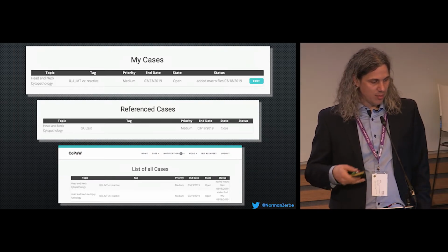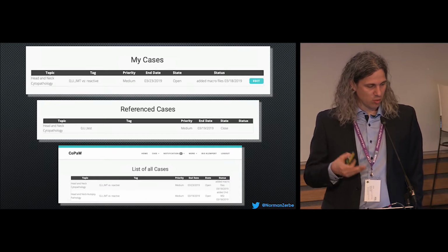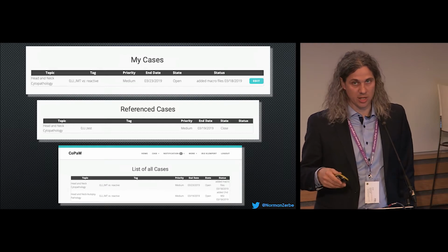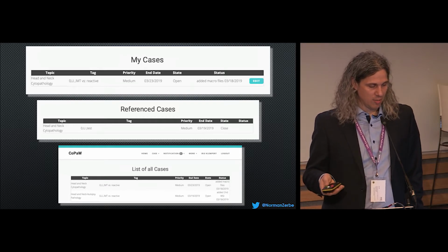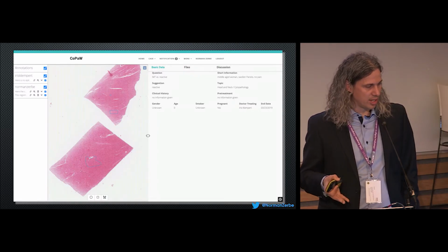And then you end up in these different tables, as I showed before. So you have your own cases, those that you are referenced in, or the list of all cases, which you can also order and then answer the cases directly. And this is how a case finally looks like.